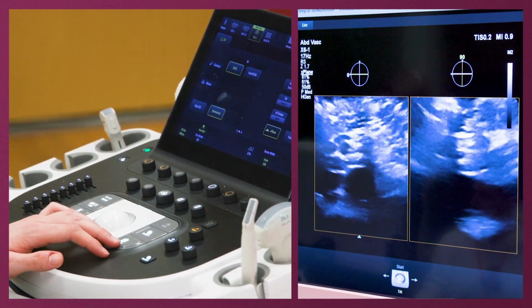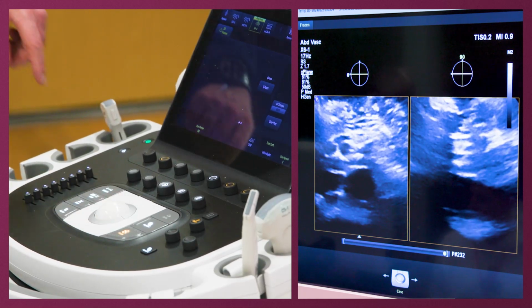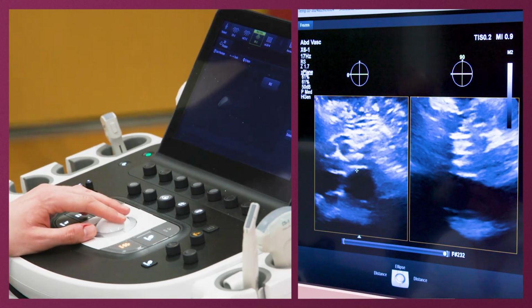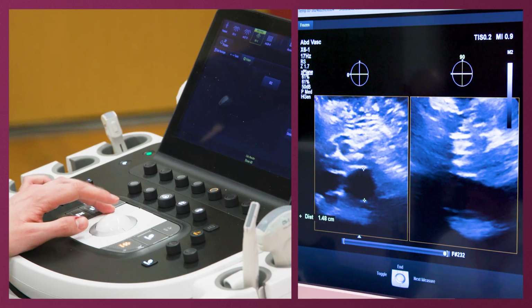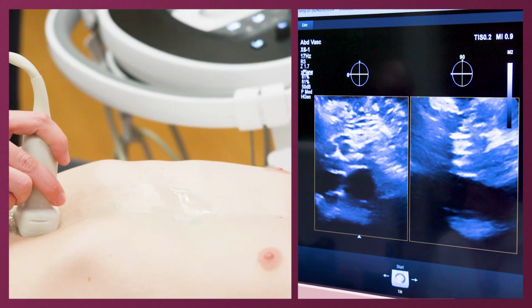Yes, that's not bad. Okay. And so I take now this is. You can do the measurements here again. See if you agree. Yes. Okay. Close. And now if I want to make a reconstruction, then 3D.